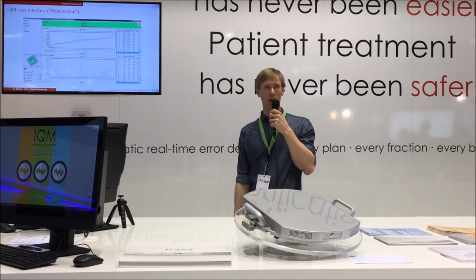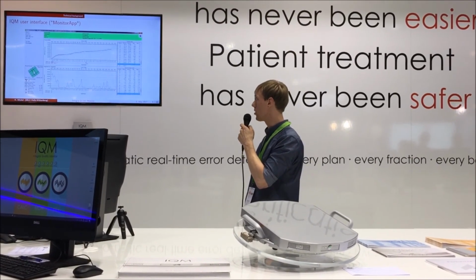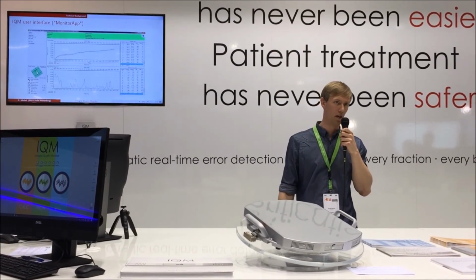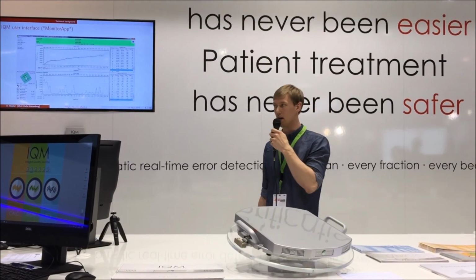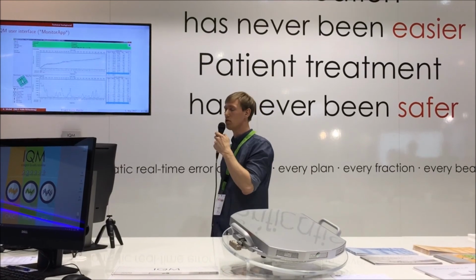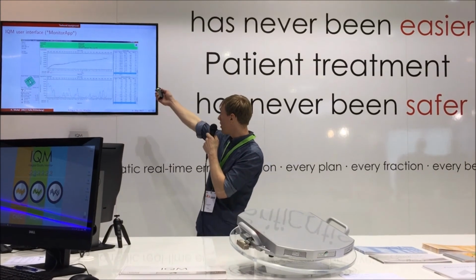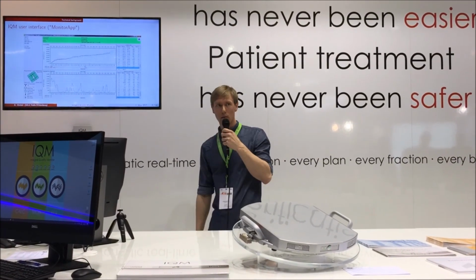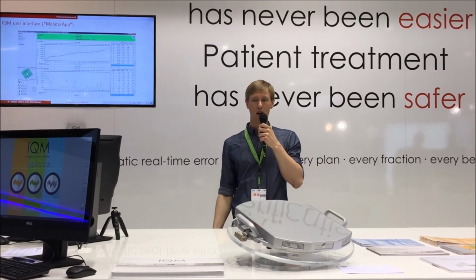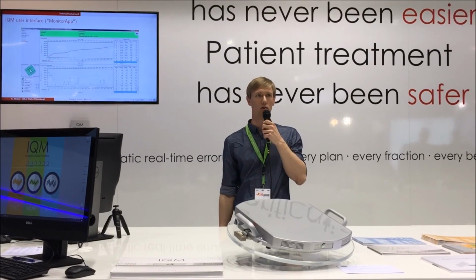So the signals are displayed within this user interface. Some of you might already know that. At the bottom we have the segment-by-segment signal, and on top we have the cumulative signal, which is basically the continuous sum over those individual signals. And the values are then compared in real time to either a measured or calculated reference that you can see in form of those green and red thresholds. If the measurement violates those error tolerances, we know that there was a clinically relevant misirradiation going on.